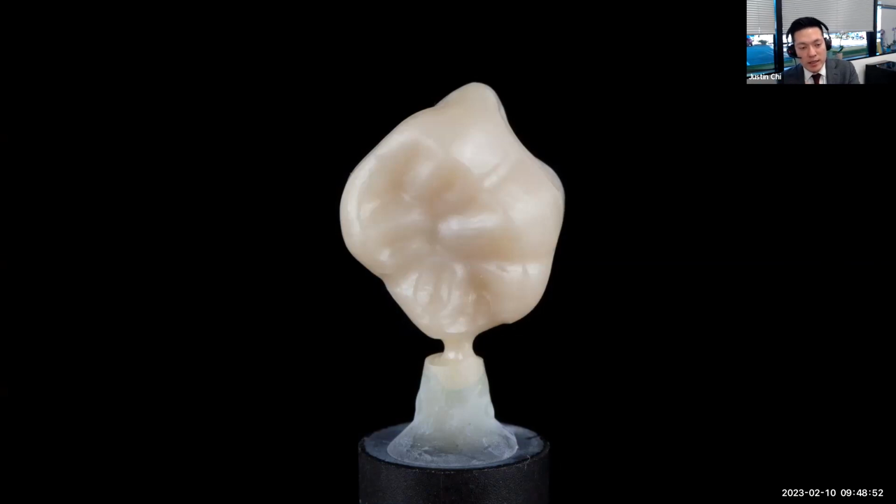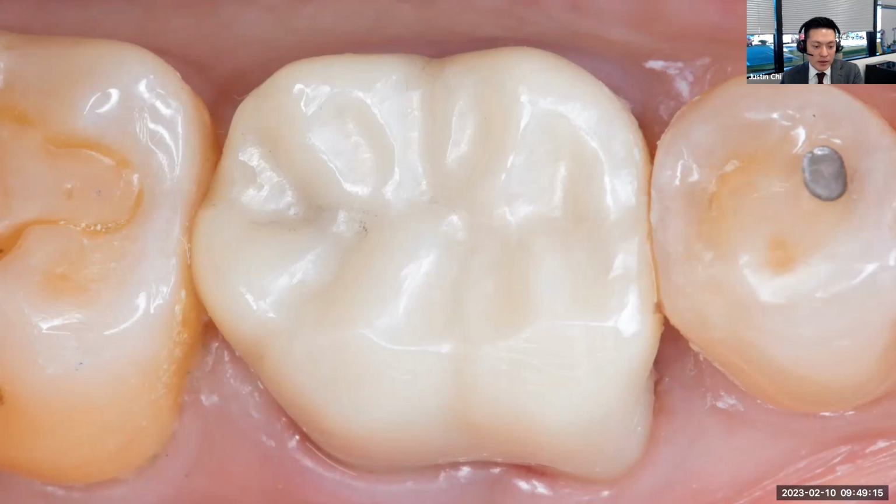So zirconia needs to go through several hours of sintering time. Depending on the system, there are chairside systems that have fast firing cycles, where it mills it in a softened state and then you can fire it chairside. But this system tries to simplify that by milling it in a fully sintered state, the only one that is available. And that just makes things more straightforward.